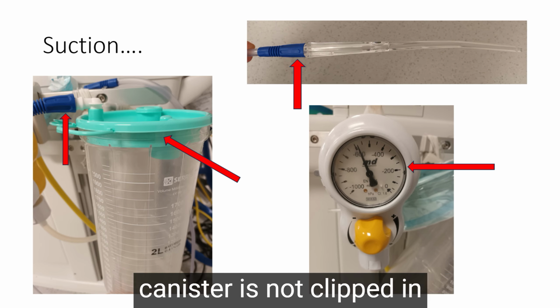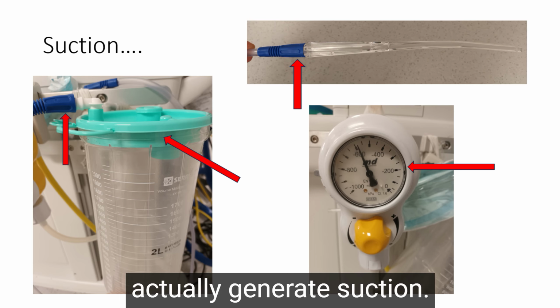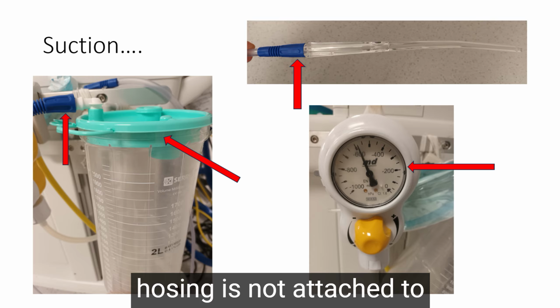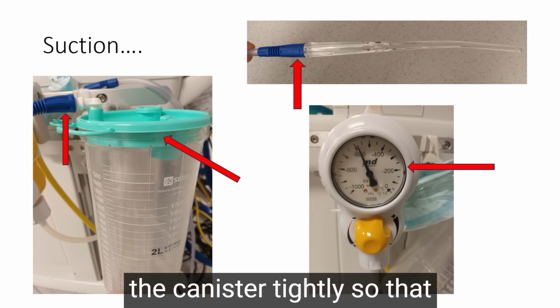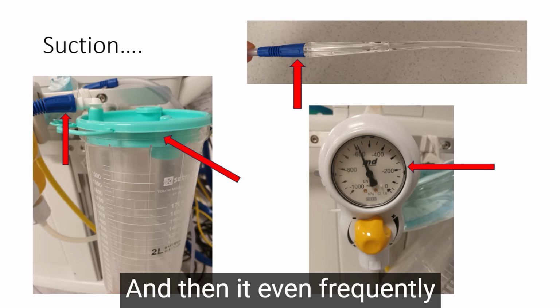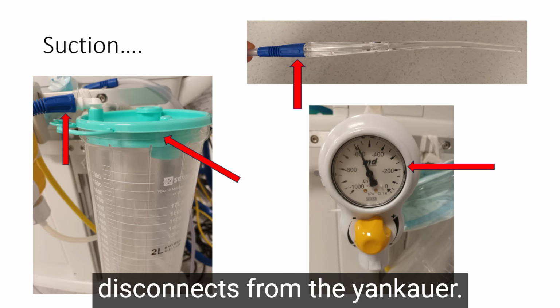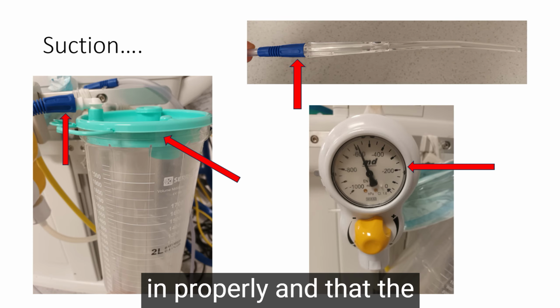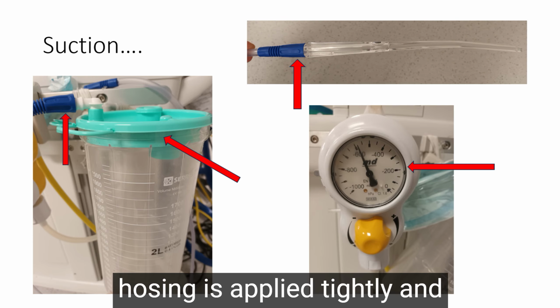The one is that the suction canister is not clipped in properly, and so you can't actually generate suction. The other is that the suction hosing is not attached to the canister tightly, so that when you pull on that hosing to use it, it disconnects, and then it even frequently disconnects from the Yankauer. So between cases, I make sure that the suction is clipped in properly and that the hosing is applied tightly.